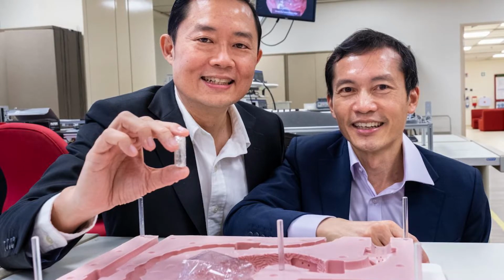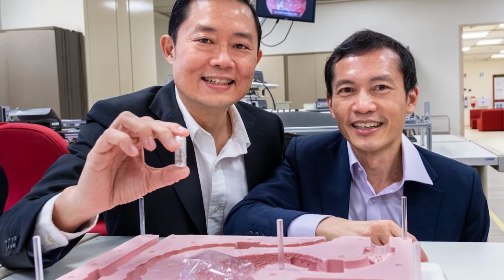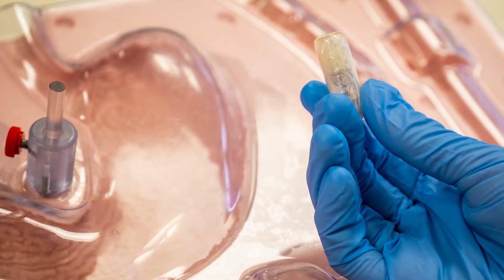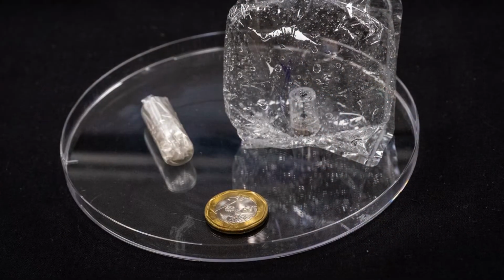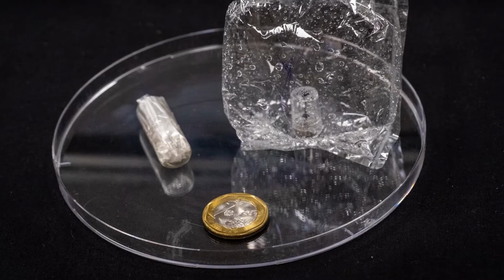The capsule prototype contains a balloon that self-inflates using a handheld magnet once it's in your stomach. The handheld magnet triggers a reaction between acid and salt, which fills the balloon with carbon dioxide and makes you feel full. The idea is that the pill will be swallowed like any other, however, researchers have yet to start clinical trials. For now, it worked on a pig that lost about 3.3 pounds in a week.